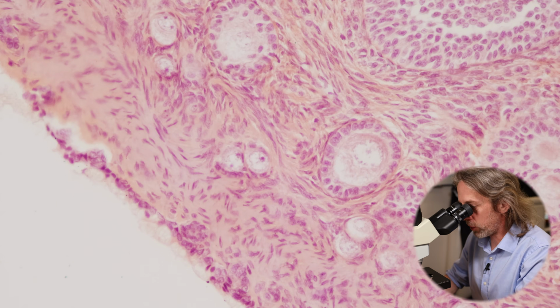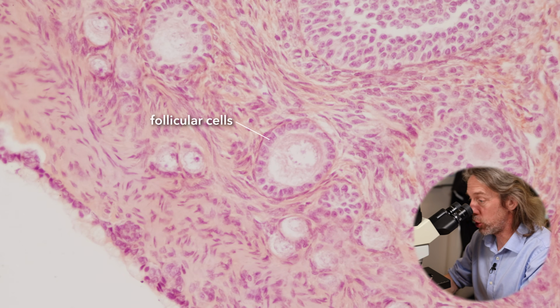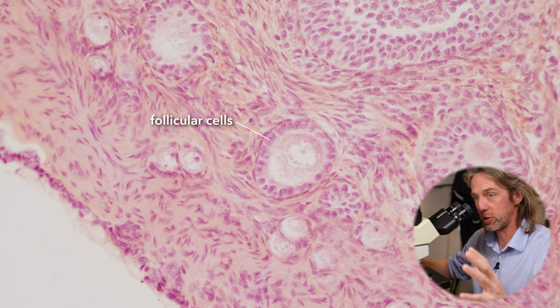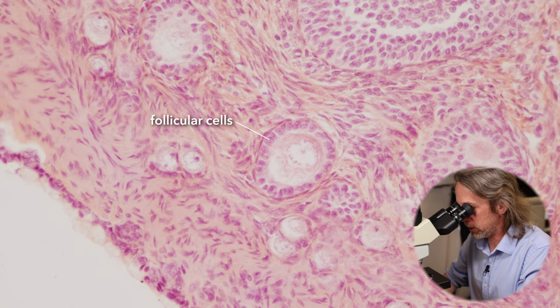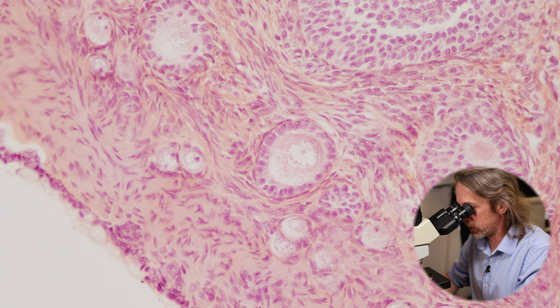We can see that the follicle has started to develop. So those follicular cells have become a single layer of cuboidal cells. These follicular cells are going to become granulosa cells. They're going to become cells that make estrogen and make progesterone and have a role in the menstrual cycle and pregnancy and that sort of thing. And in the middle there, we have that primary oocyte. So it's still a primary oocyte and it's getting bigger. And the follicular cells are supporting that growth.